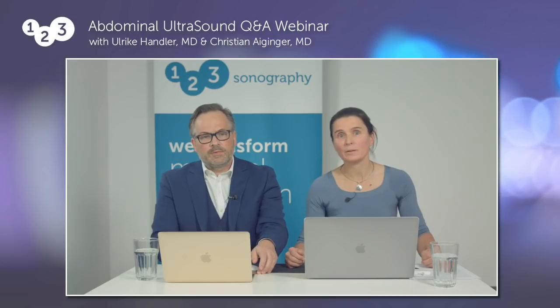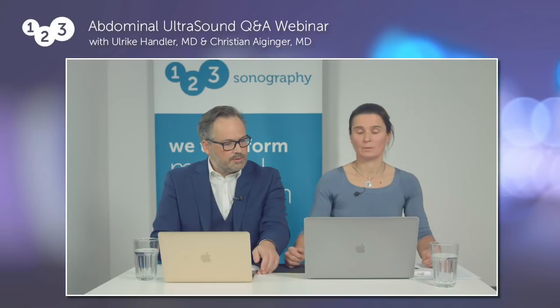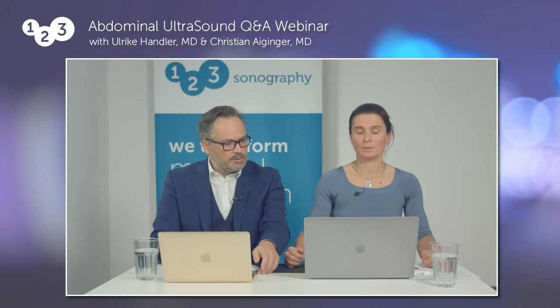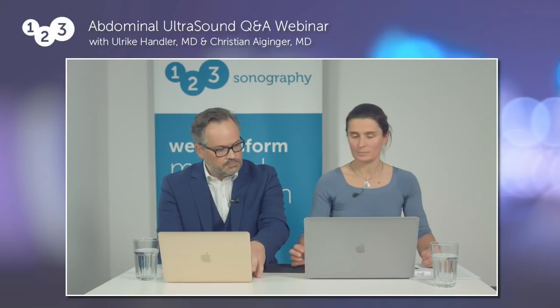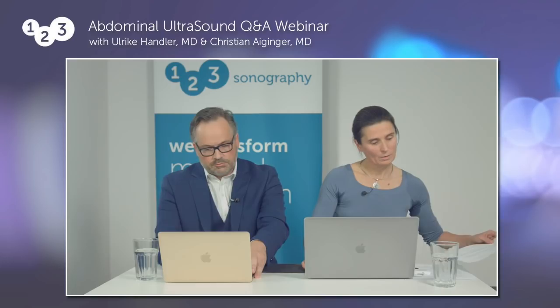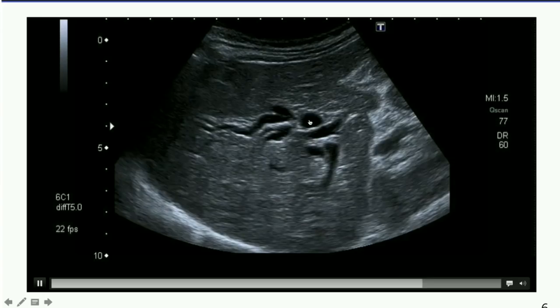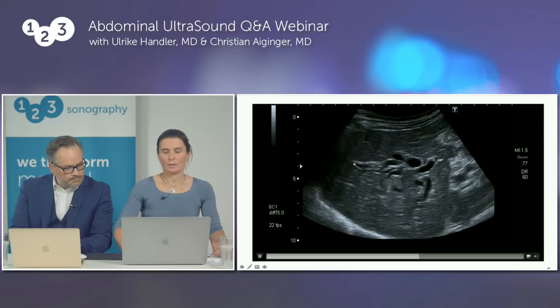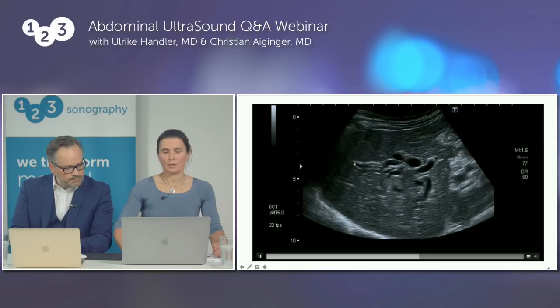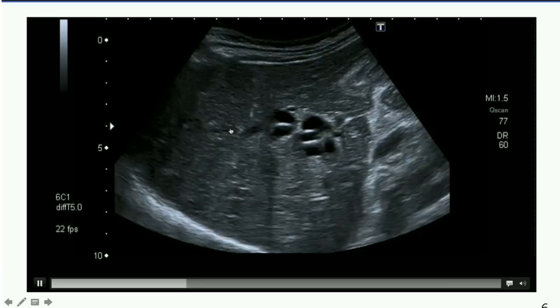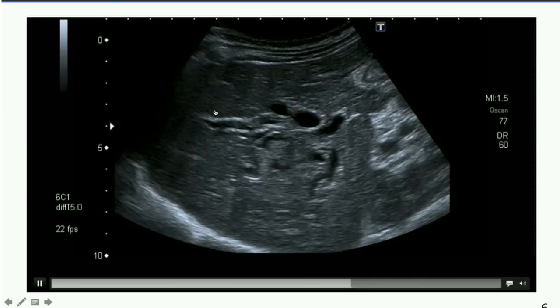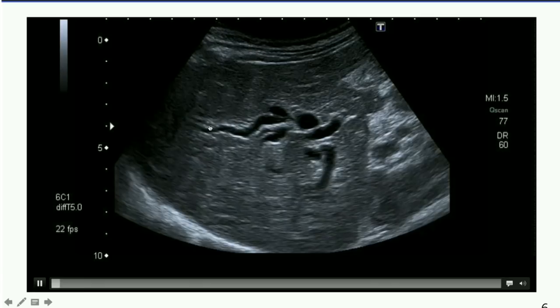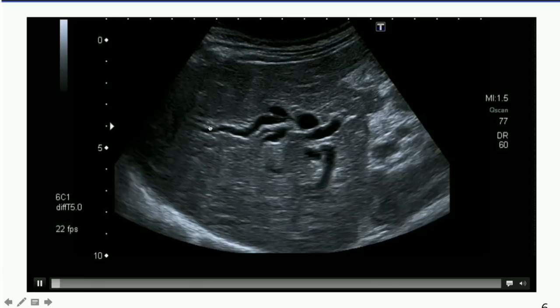Imani asked about biliary obstruction — what does it look like in ultrasound? Here we have a clip of the right liver lobe. We can see double contours: normally intrahepatic bile ducts are not visible — you only see branches of the portal vein. When you see these double contours parallel to the portal vein branches, you have dilated bile ducts. This is called the 'double barrel shotgun sign,' and it clearly indicates biliary obstruction.